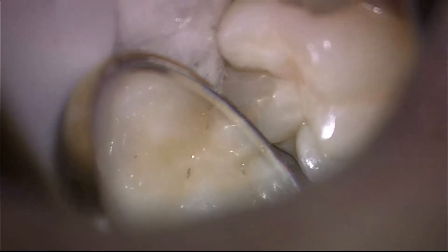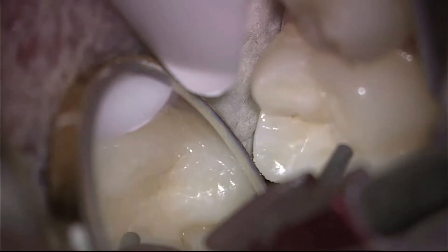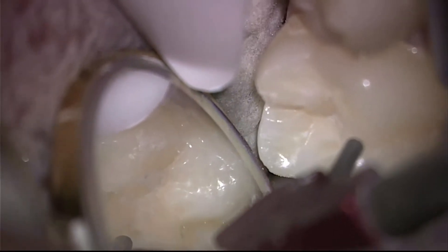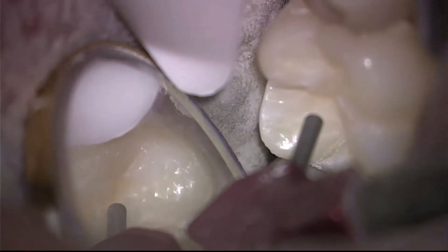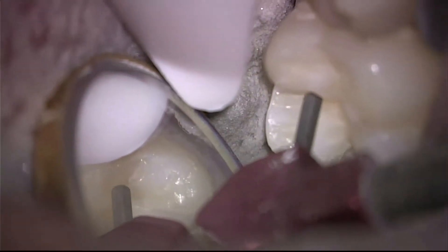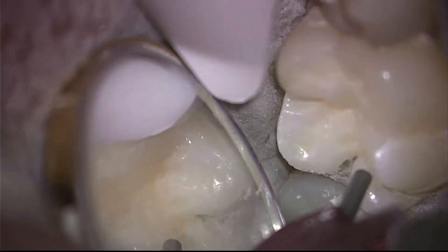So let's look at a couple of teeth here. This is an example with micro-air abrasion starting to clean out the grooves and pits. This is the most minimally invasive way to clear the grooves of organic matter, stain, debris, and prepare them for a permanent restoration.